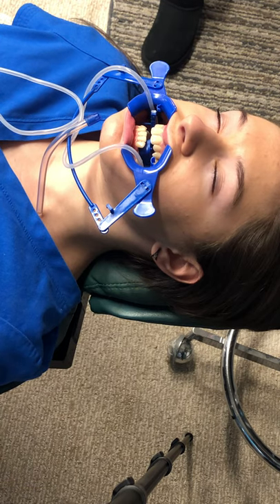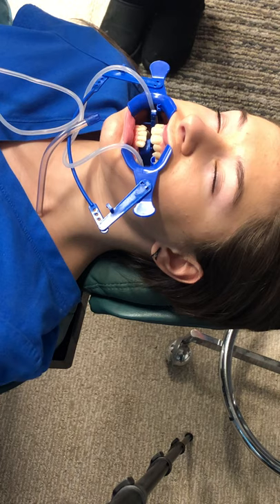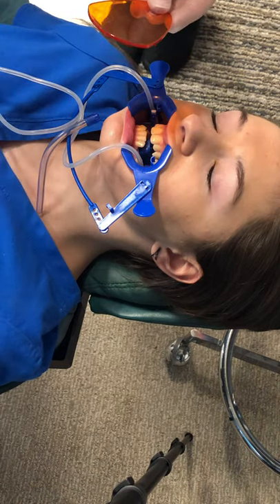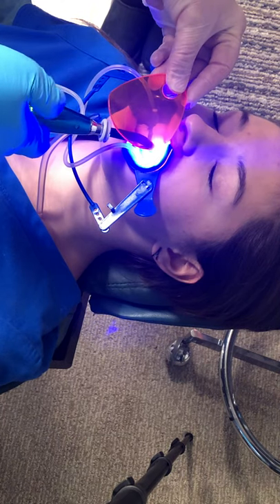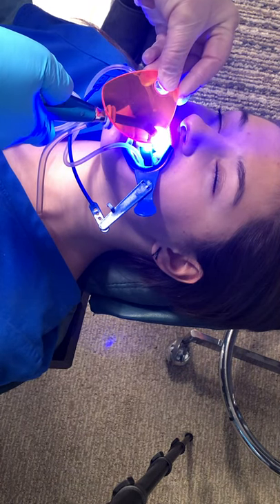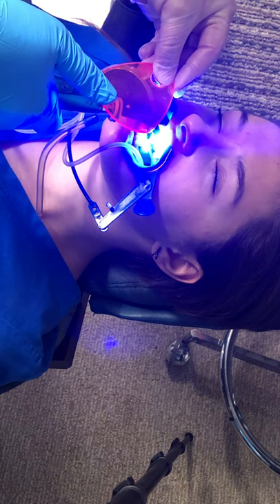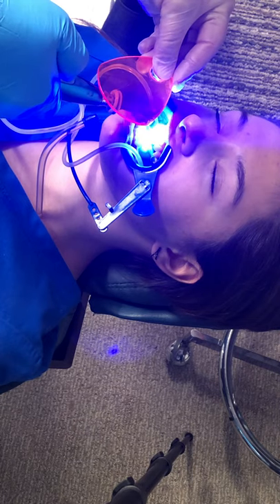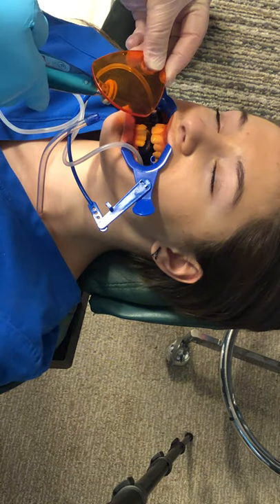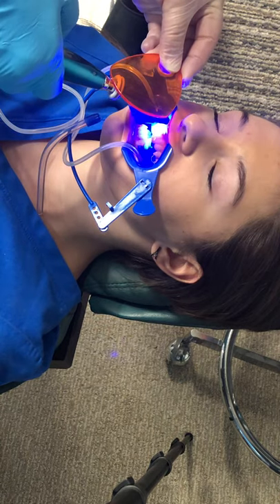This is your curing light. I'm going to set it to 10 seconds. This is your amber light so that you don't look at the bright light directly. You do 10 seconds per tooth and it automatically cuts off. Alternatively, you could put it on 20 seconds and count — two beeps per tooth.